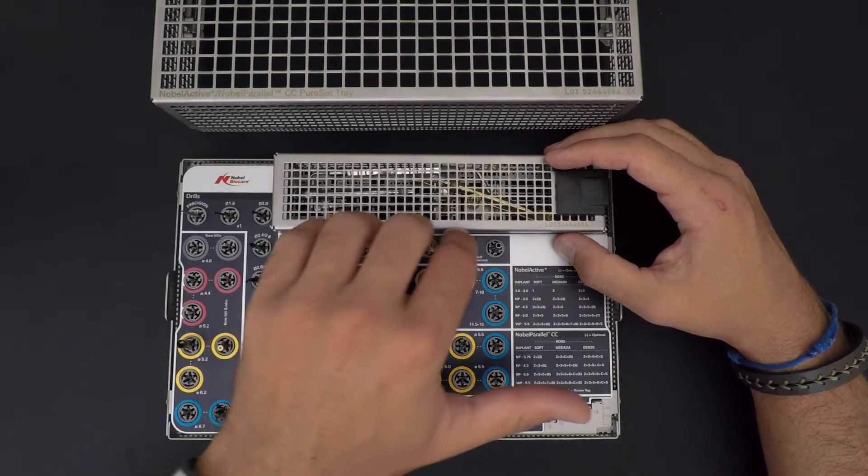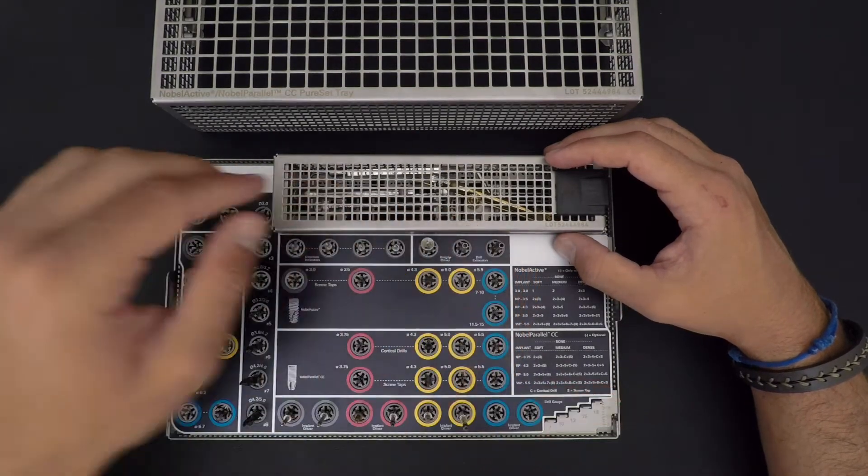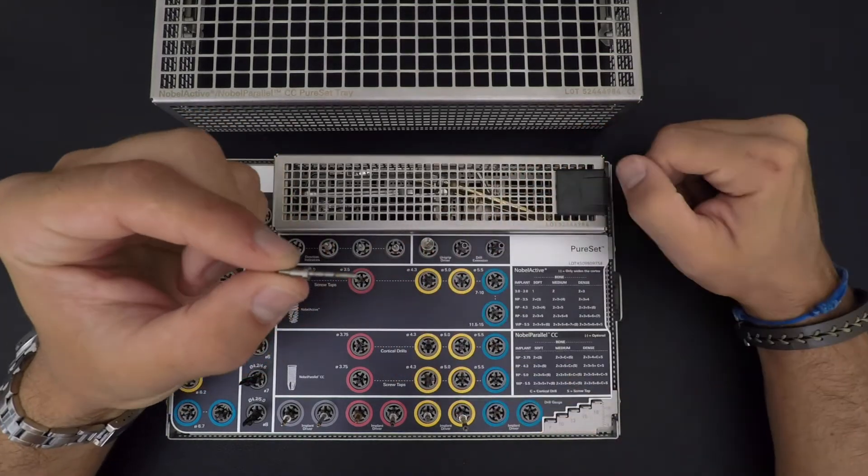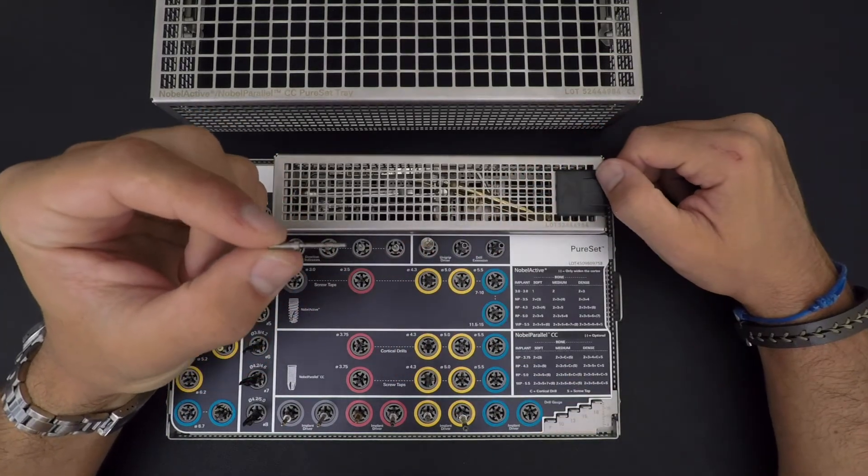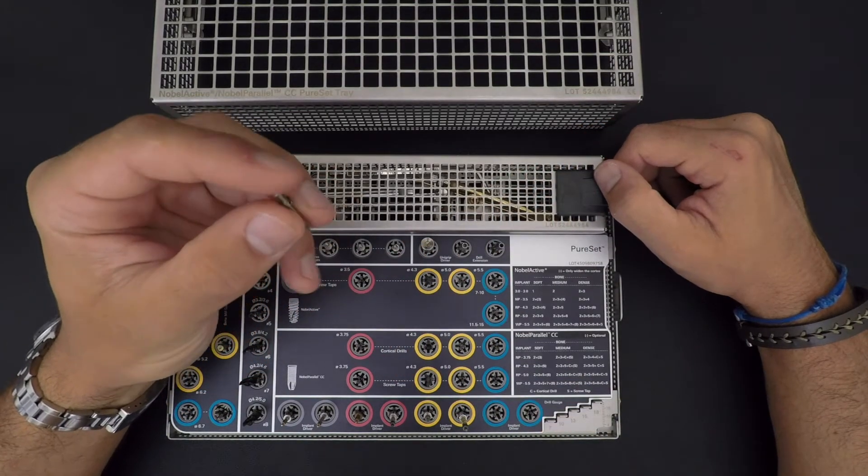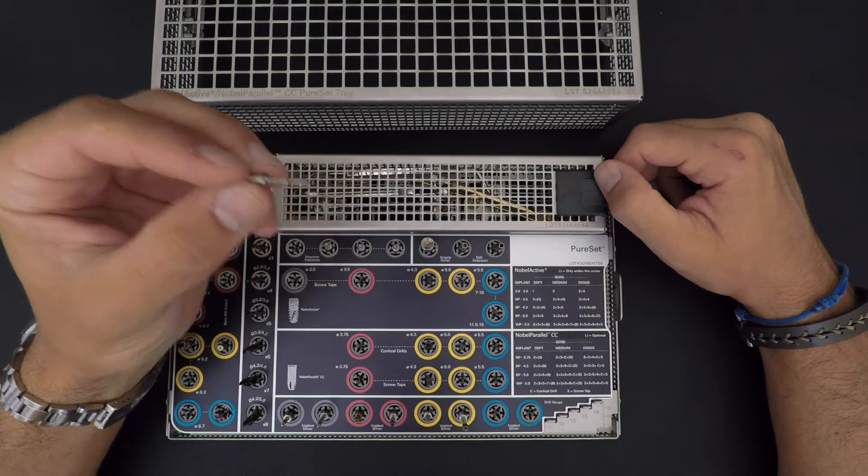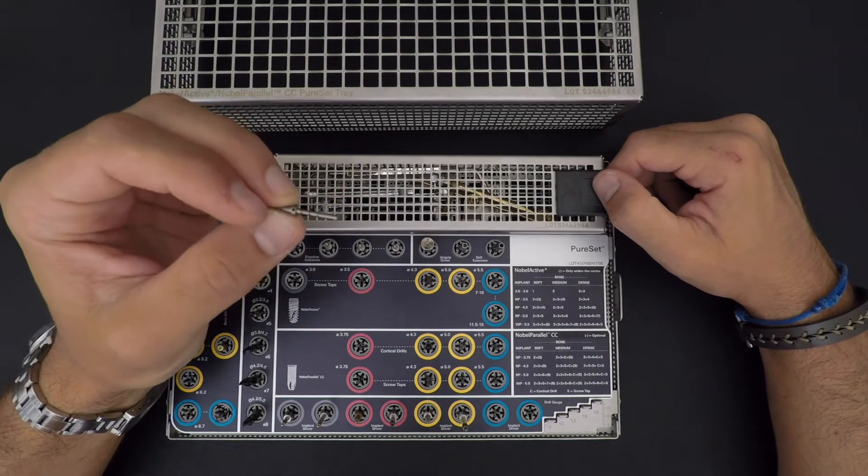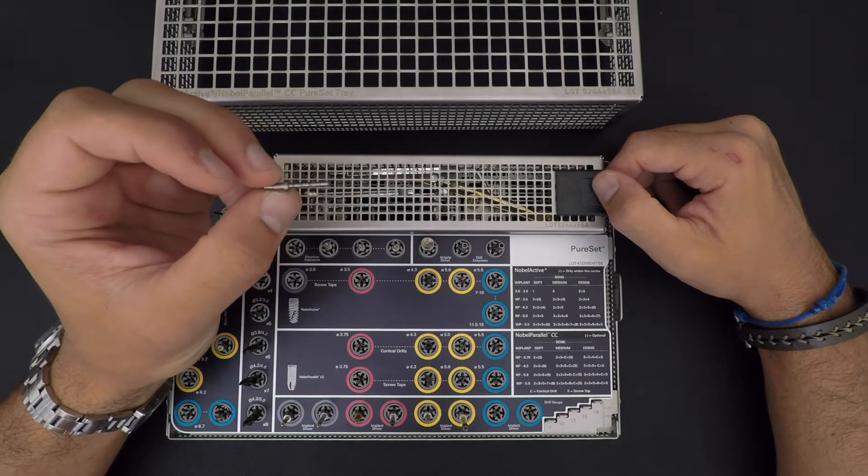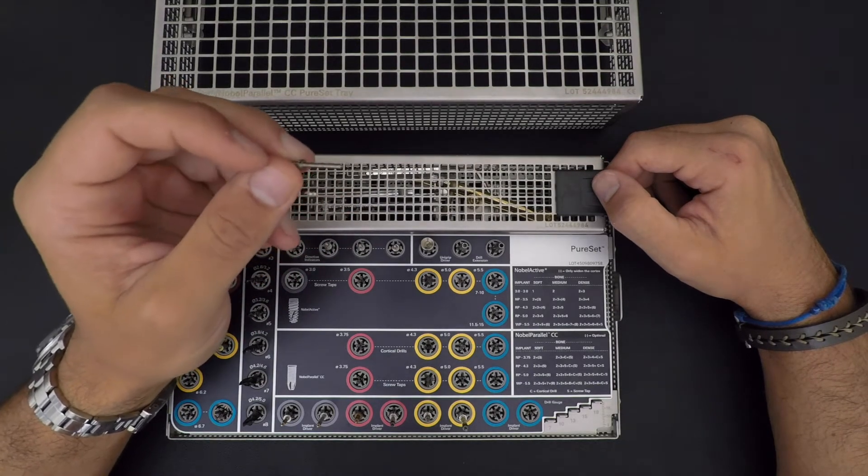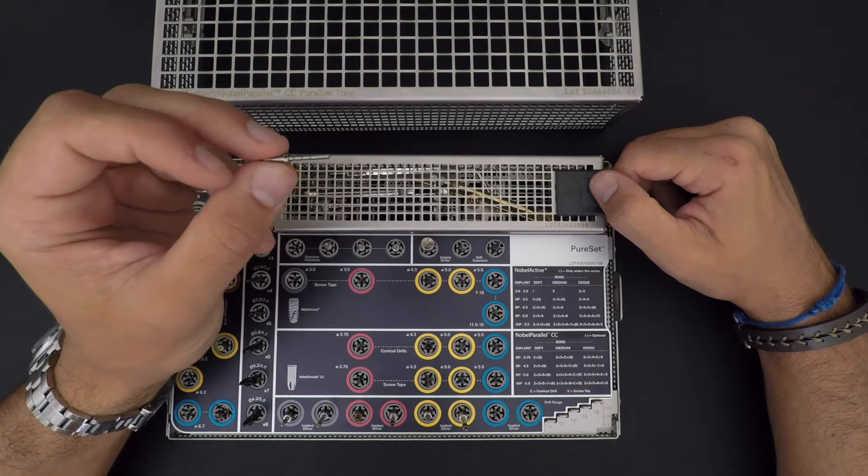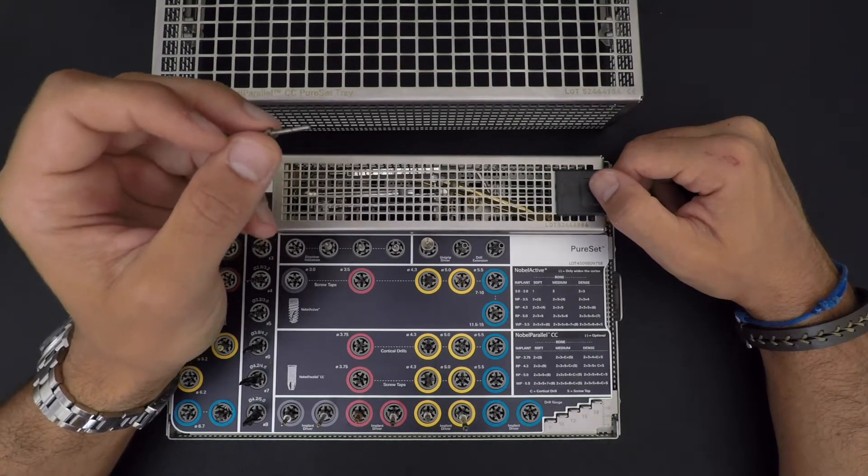These are your direction indicators. You can use it straight from the beginning after you've done your two millimeter twist drill to look if you actually reach the depth you want, but you can also take an X-ray to look at the indication and direction of your first drill.